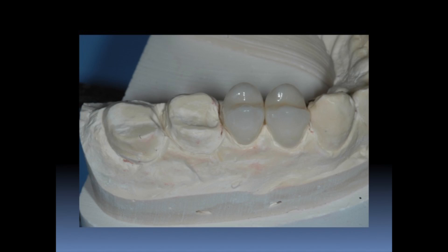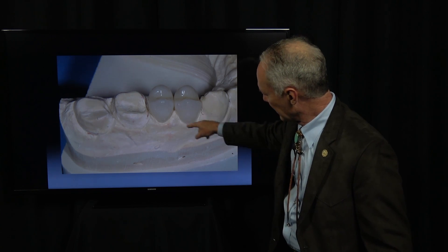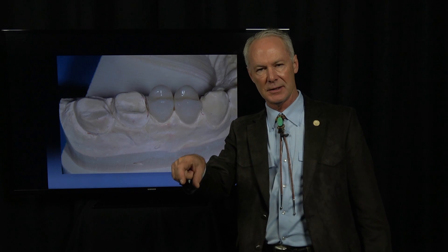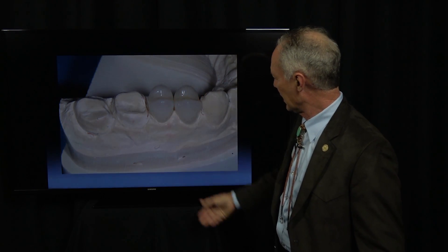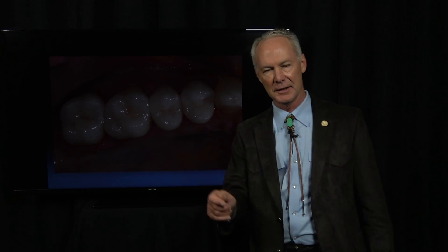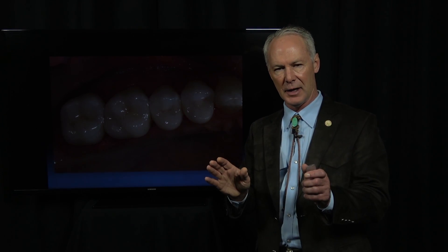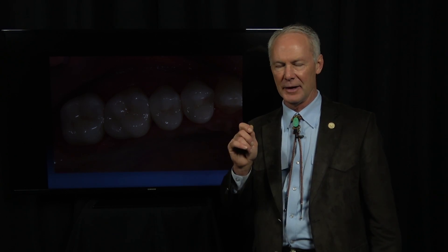Here are the crowns going on the stone model — the solid model. But the margins do not touch stone. That's very important. If the margins touch stone, it may not seat and it won't be an accurate model for perfecting the interproximal contacts. Here are all the crowns on that model. And that's the Dental Minute. Never again will you have to adjust an interproximal contact on a crown. These techniques work and they work every time.